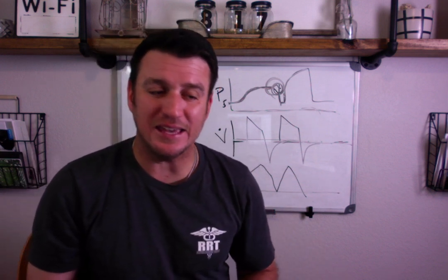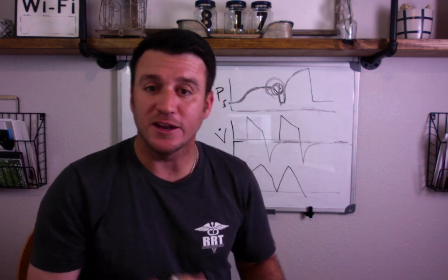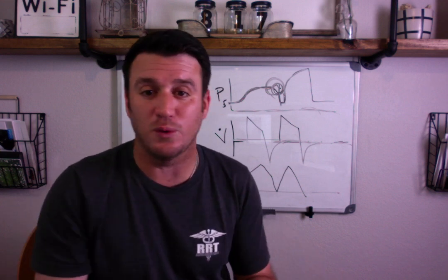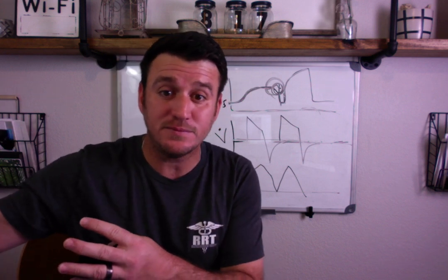Breath stacking is something that I never saw early on in my career. And the reason I never saw it earlier on in my career is because when I first started, we were doing tidal volumes of 8 to 12 mLs per kilo. That's ginormous breaths.